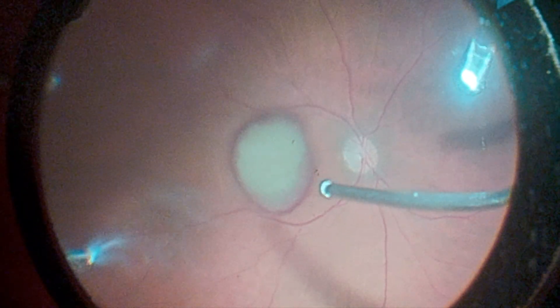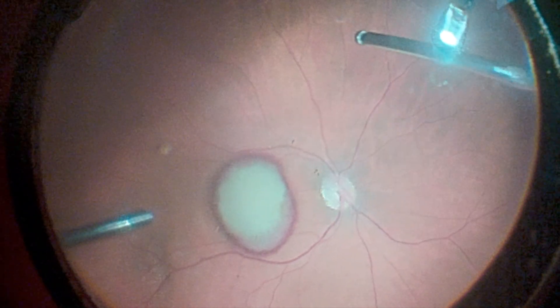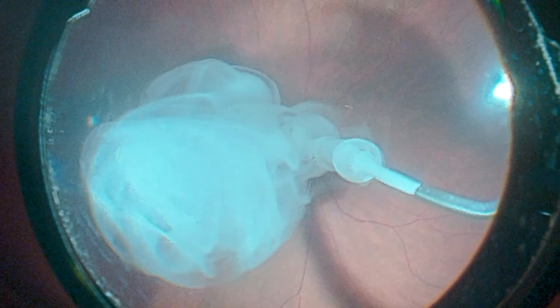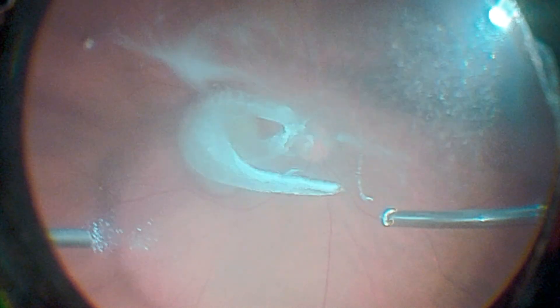This is the case of a young woman who presented with sub-ILM hemorrhage due to Valsalva retinopathy in her left eye. During the vitrectomy, we can observe the presence of whitish material in the macular region, resulting from the catabolites of hemoglobin, which can potentially be toxic to the retina, justifying surgical treatment.